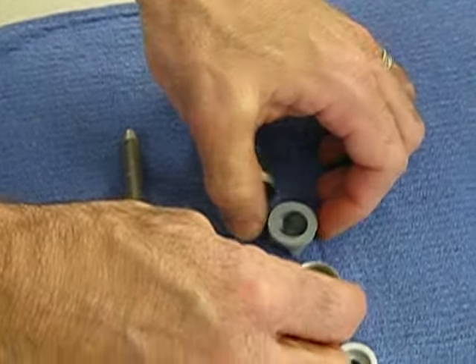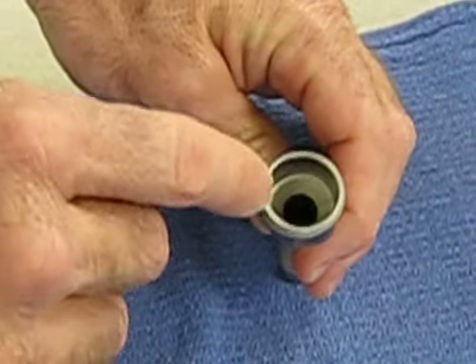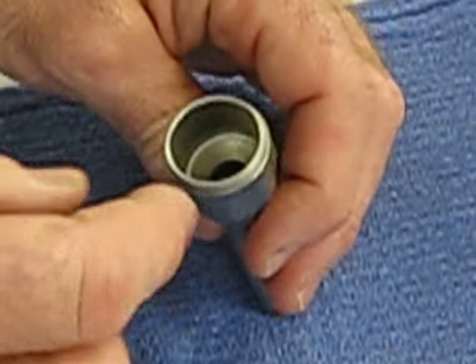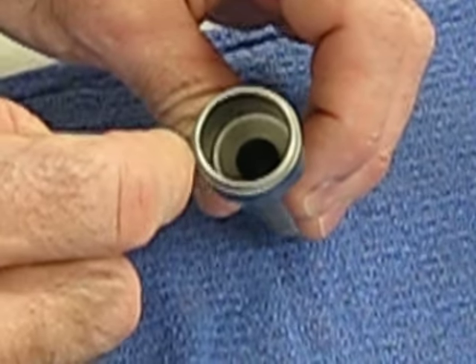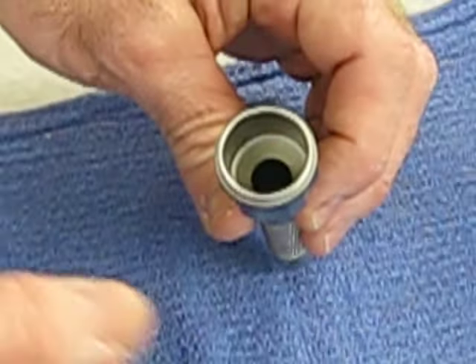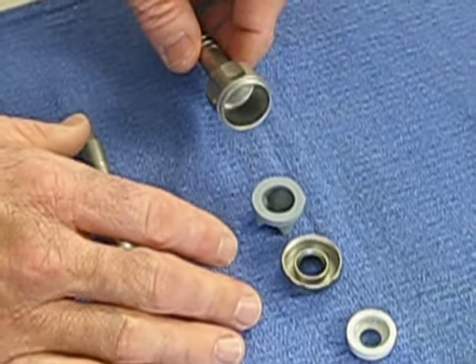You want to pull that out and make sure you clean inside of there. All of these can be soaked in the enzymatic cleaner. And then you want to clean out inside the barrel of the cannula. There are brushes that can go down through to clean out any organic matter that doesn't come out with the enzymatic cleaner. Make sure you have it dried out before you put it back together.